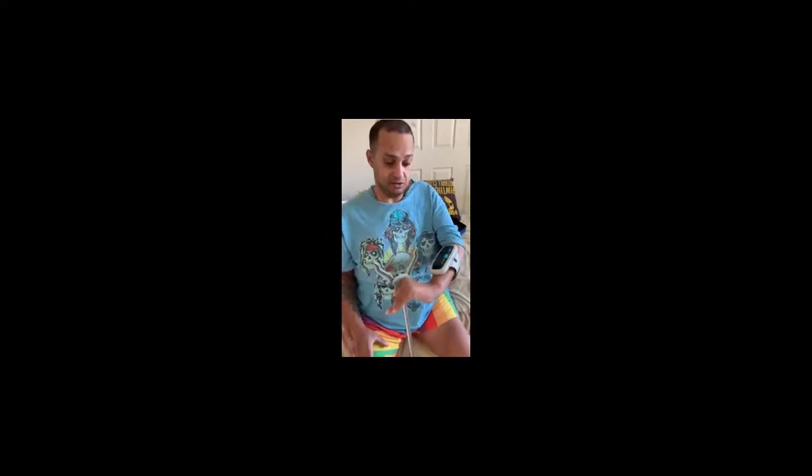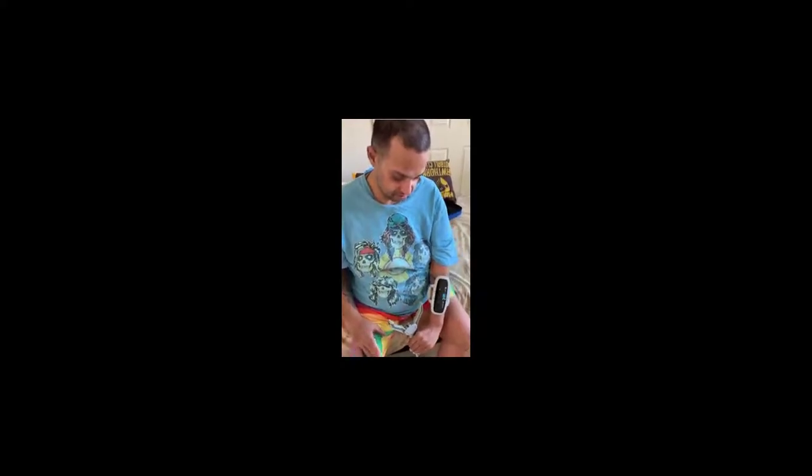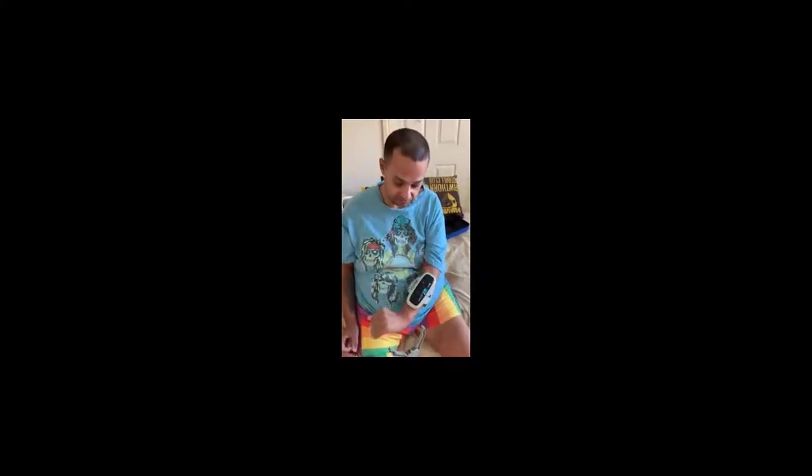Now I'm going to release it by counting 1, 2, 3. My hand is open. I'm putting it down. Okay, 1, 2, 3, open hand. Put it down to relax. Just need to relax the shoulder and arm. I'm going to remember that.